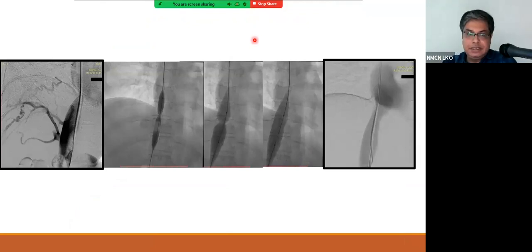So this is an example of how we do angioplasty. Here in the DSA venography image, we can see there is a marked stenosis of the upper hepatic IVC with drainage via collaterals. This stenosis has been crossed with the help of a guide wire and catheter, and a smaller balloon has been deployed across it. Serial balloon dilatation is done with larger balloons. The balloon is fully deployed, and post angioplasty, we can see there is excellent restoration of antegrade flow from the IVC to the heart, just with angioplasty.